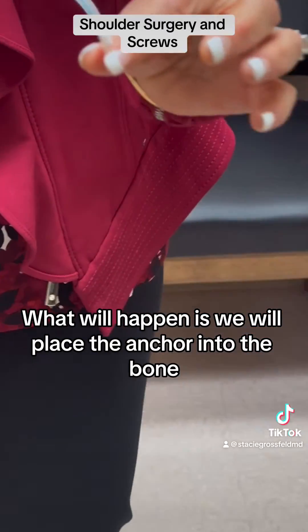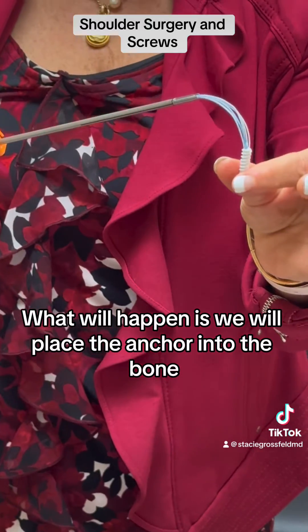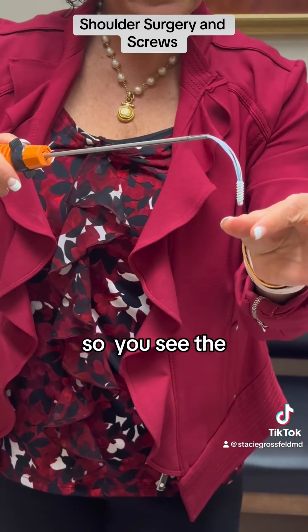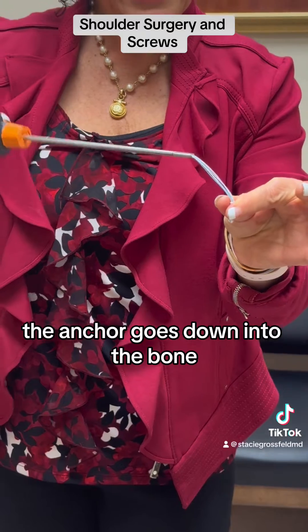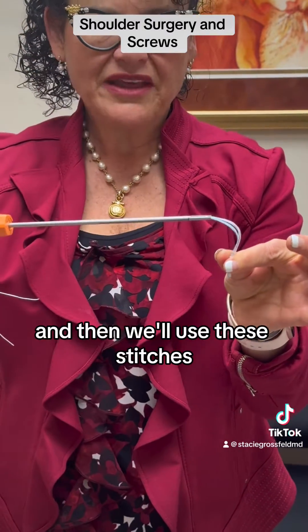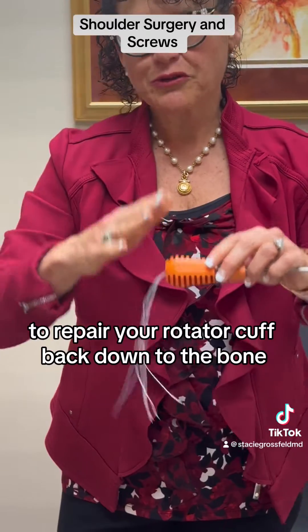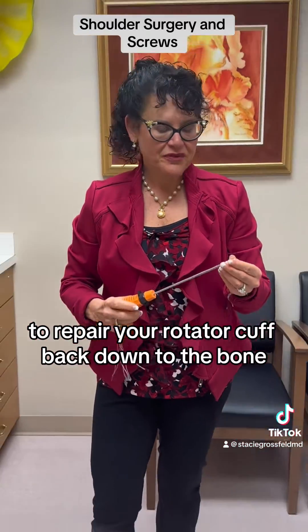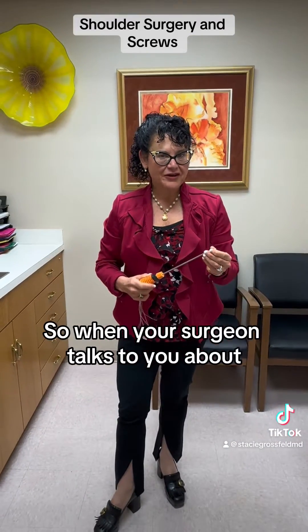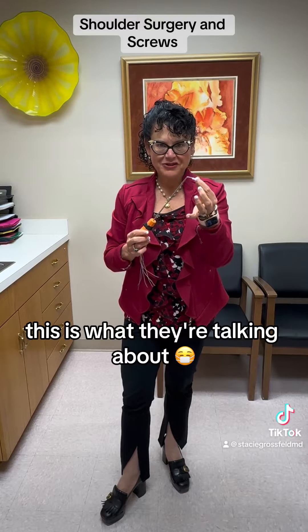What will happen is we will place the anchor into the bone, so the anchor goes down into the bone, and then you'll have the stitches attached to the bone. Then we'll use these stitches to repair your rotator cuff back down to the bone. So when your surgeon talks to you about hardware or screws going into your shoulder, this is what they're talking about.